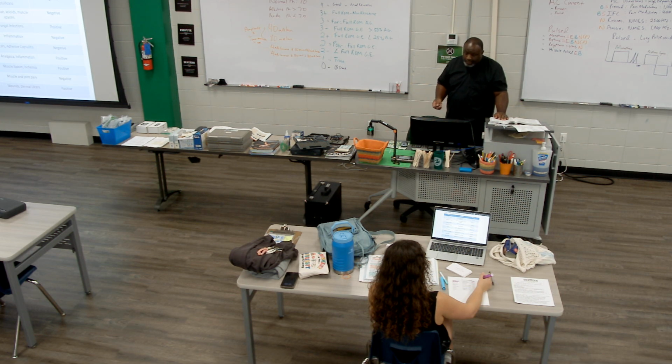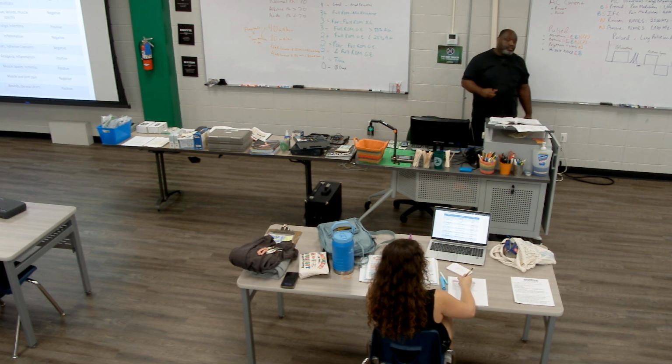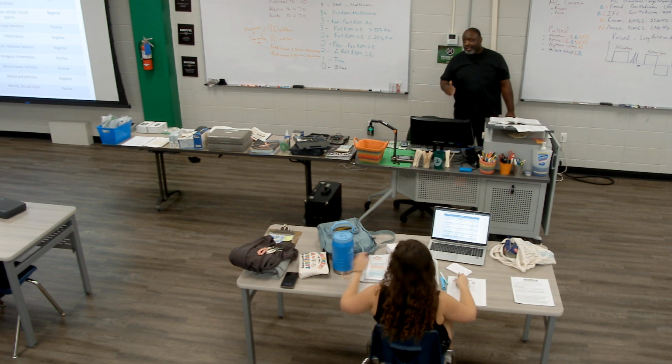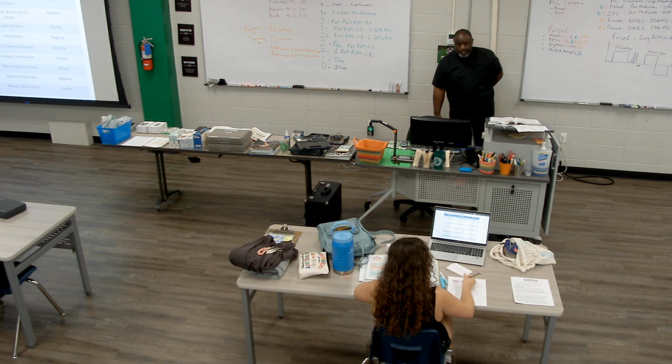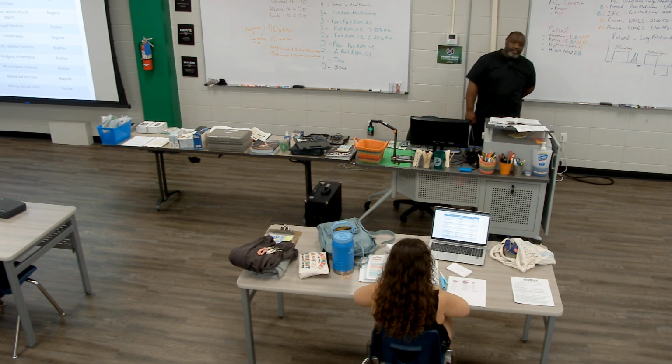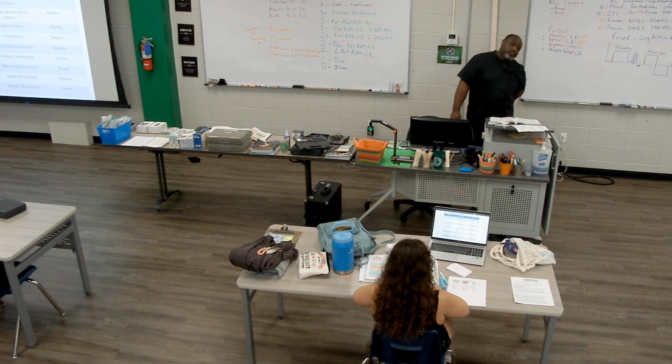Copper. Never have I seen anyone iontophoresis copper in my life. It may be done for fungal. Dexamethasone phosphate, they really should say dexamethasone phosphate, is one of the main things you're going to see iontophoresis. Dex is going to get iontophoresis. If there's one drug on here that you'll see, Dex is going to be the one. It's that important. It's an anti-inflammatory, steroidal anti-inflammatory. So steroid anti-inflammatory, SAID drugs.